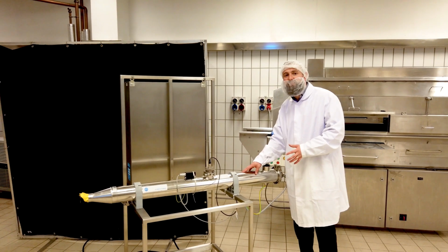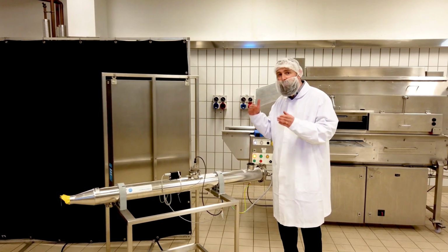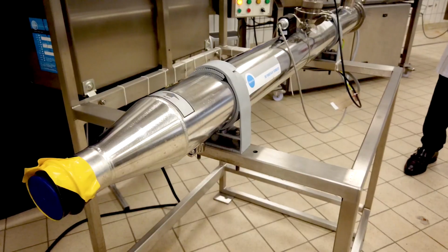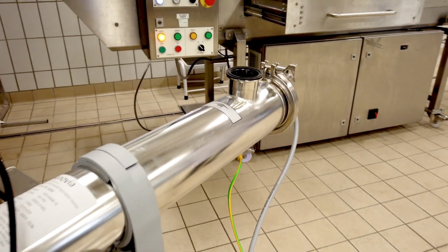This is another UVC treatment system, but this one is for liquids. Primarily high transmissive liquids where the UVC can penetrate through the liquids and decontaminate it. The water will flow in through the start and it will pass over the UVC lamp where it will decontaminate all the bacteria before it will go off into the production run.